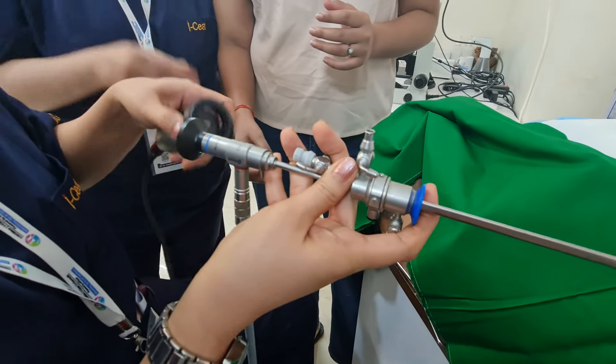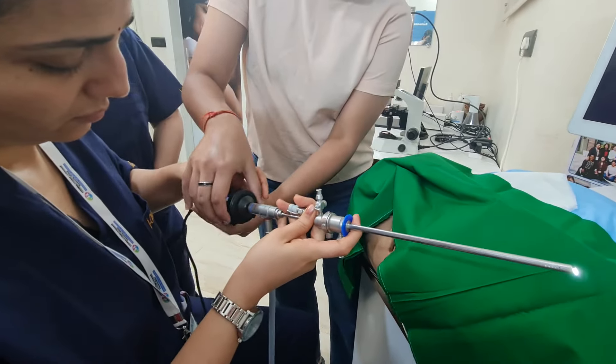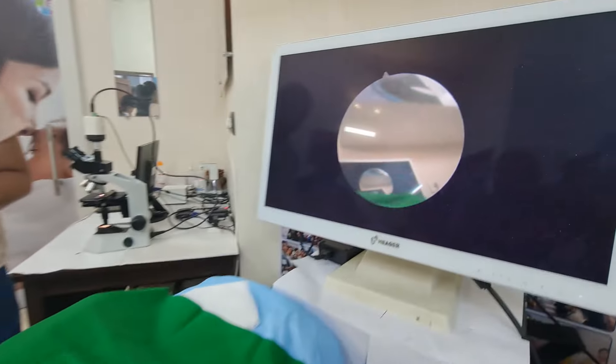Then you have to attach the camera. Press. Now your hysteroscope is ready.